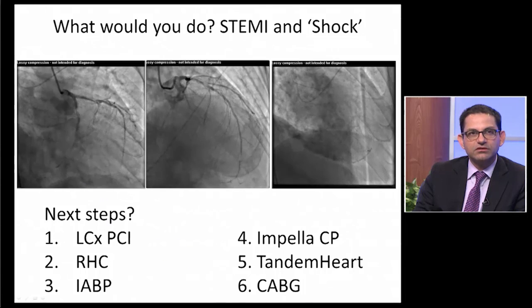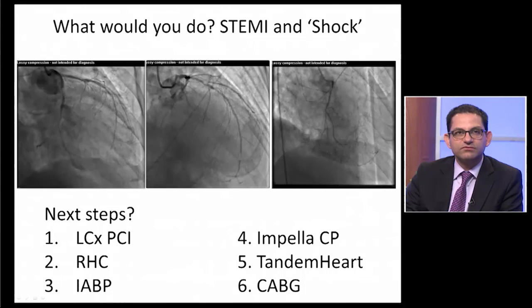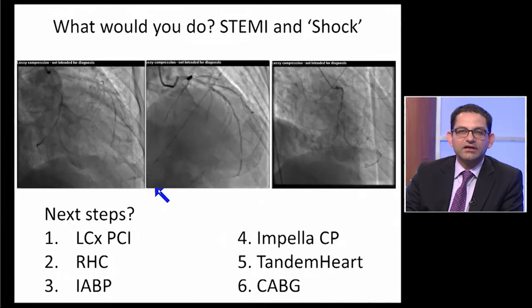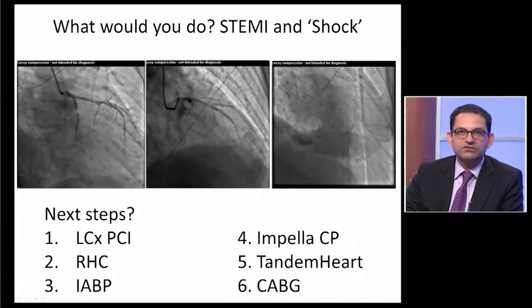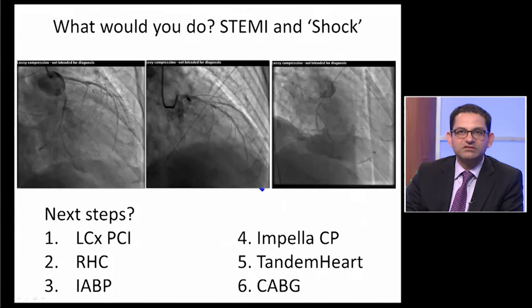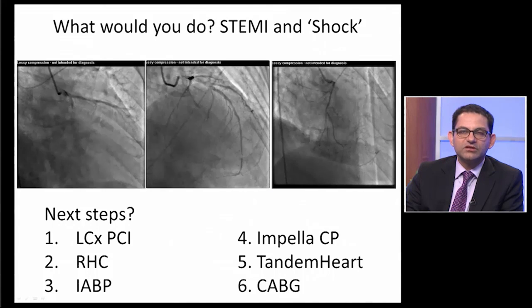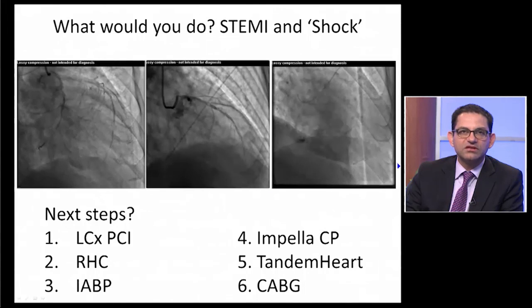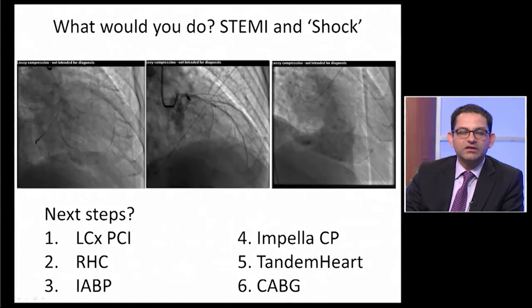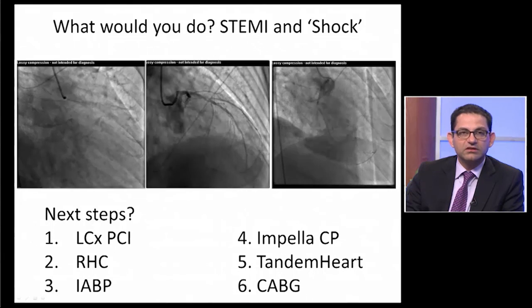And what you'll see here on the angiogram on the far left is a thrombotic occlusion of the left circumflex with TIMI-1 flow through a very large circumflex system. And on the LAD here in the middle panel, you'll see that there's a large LAD, but it's diffusely diseased. There's some mid-segment disease. There's an apical segment that's virtually occluded. And on the right is a non-dominant right with very small collaterals going to this apical segment of the LAD. So multivessel disease and a left dominant system involving the LAD and the circumflex. The circumflex is the culprit vessel that we would target.